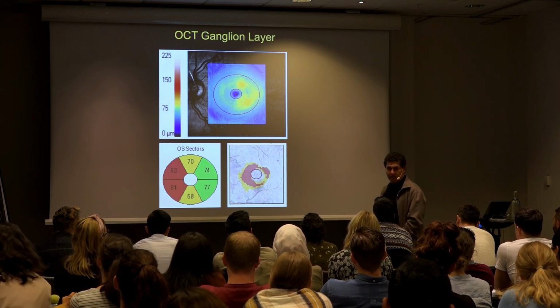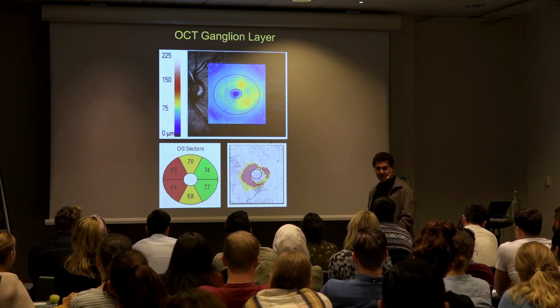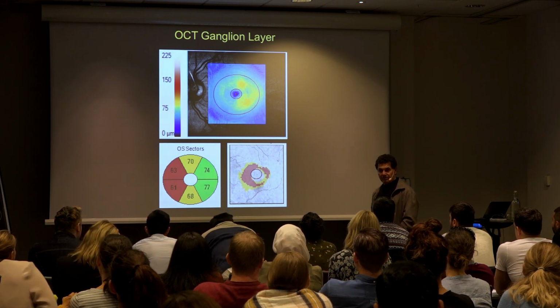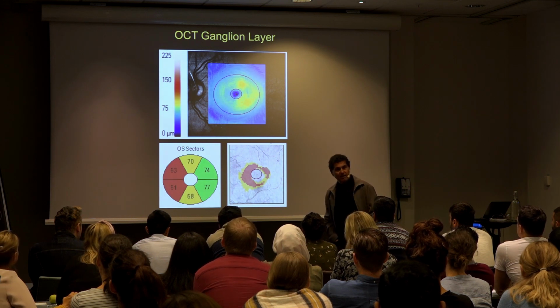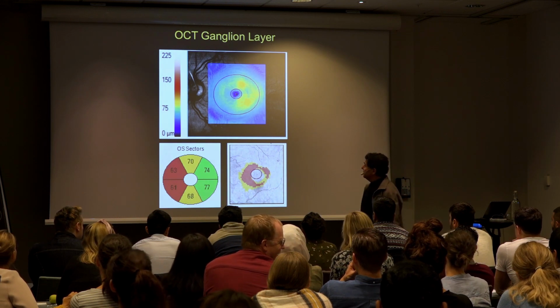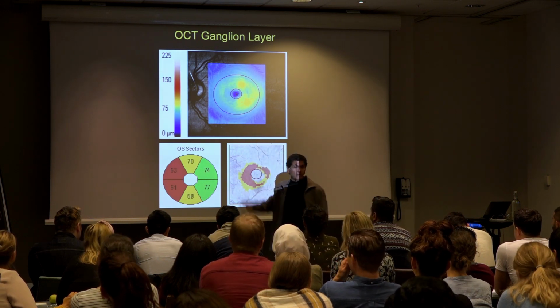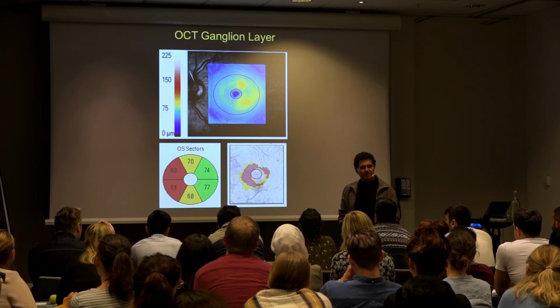So you've got somebody who's referred for early glaucoma, and you've got this ganglion cell layer with nasal thinning. So what does that mean? It should be thinner there, but does it ring any bells? Okay, beginning of glaucoma, but why does it look like half of the ganglion cell layer like that? It's a bundle. So there are macular arcuate bundles, but those are like other arcuates, they don't respect the vertical. So that doesn't quite fit. Is it retrograde atrophy?